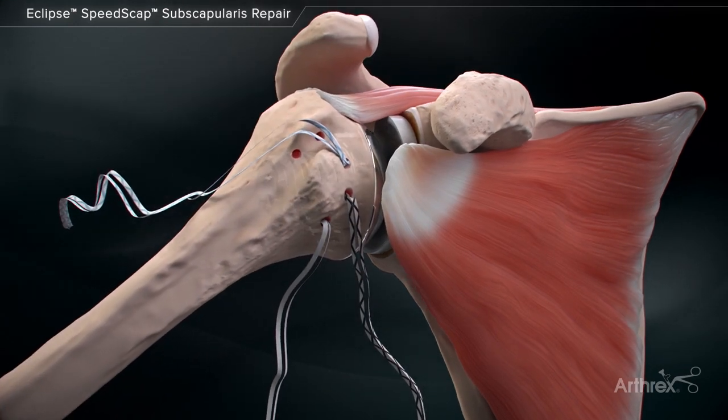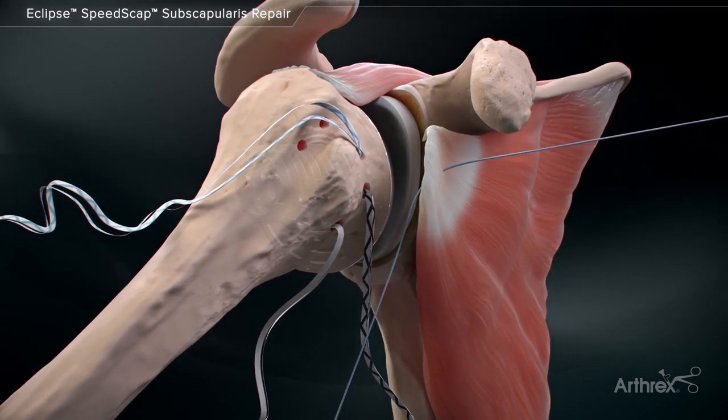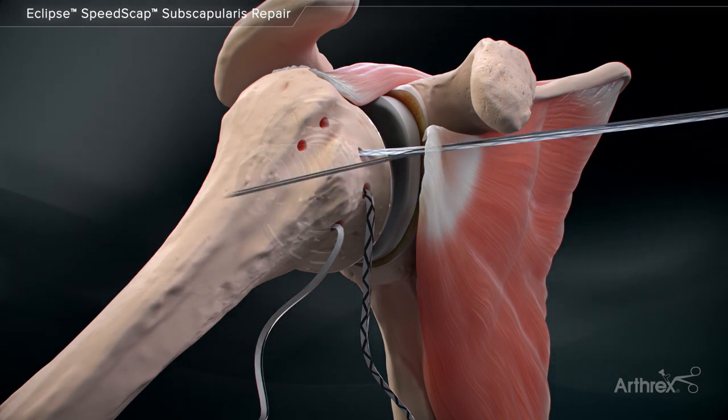After all medial row anchors are placed, pass each limb of labral tape in sequential fashion and appropriately spaced through the tendon of the subscapularis, ensuring to remain lateral to the musculotendinous junction.